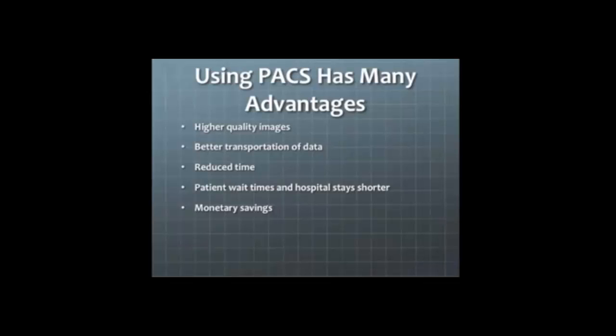Patient wait times are reduced and hospital stays are shorter. Prior to PACS, patients had to wait for the film to process to judge the quality of the image, and sometimes additional films would be needed. Patients will receive less radiation exposure from X-ray equipment, and it reduces the amount of incidences of patients having adverse reactions to contrasting dye. There are also economic savings from switching from film-based to digital, which can be felt in many areas.